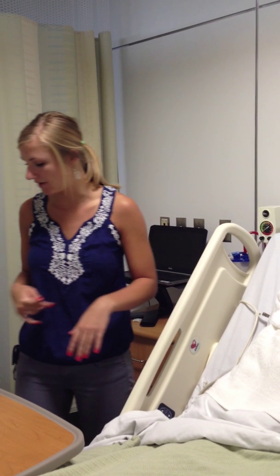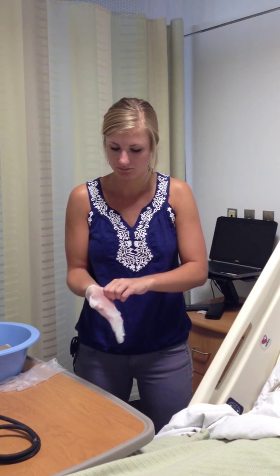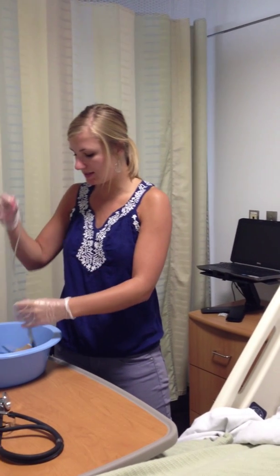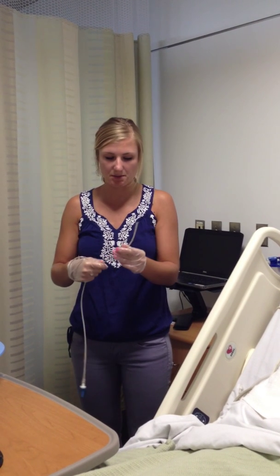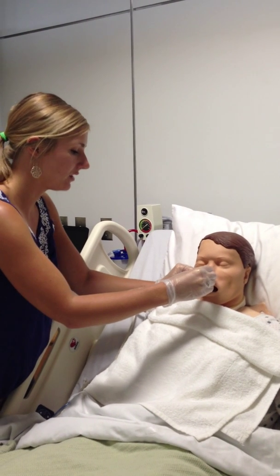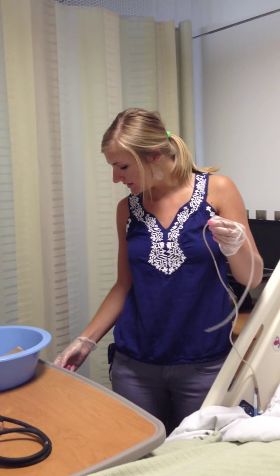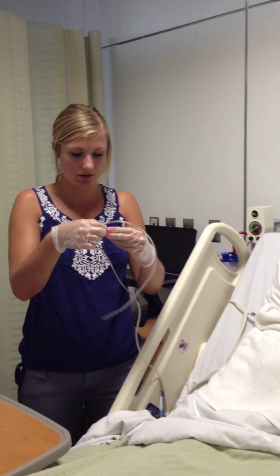I'm going to put a towel over there so we don't spill any gastric contents onto their gown, and then put my gloves on. I'm going to inspect the tubing and check for any rough edges or kinks, because we don't want to put a rough tube down someone's nose. Then I'm going to measure it for length by starting at the tip of their nose to their earlobe and down to the xiphoid process, and place a piece of tape there so we know how far to push the tube into their nose and down into their stomach.